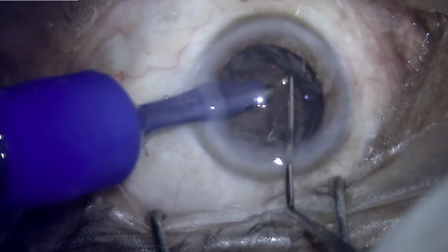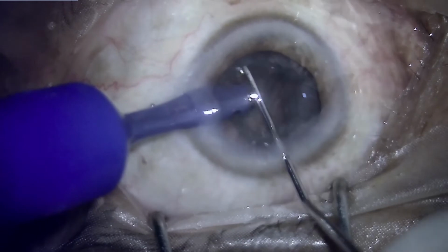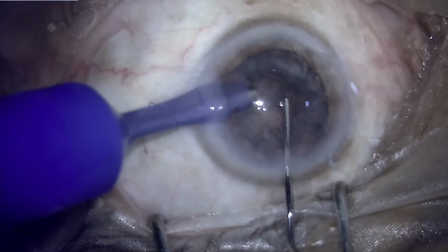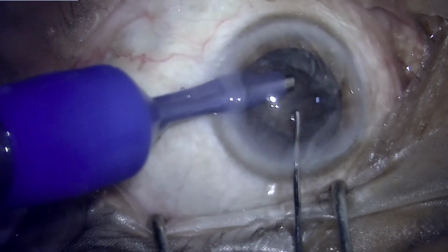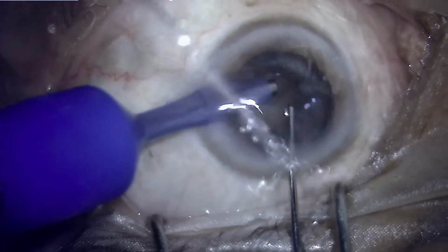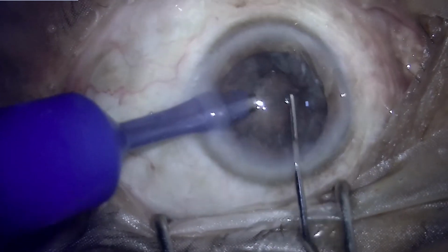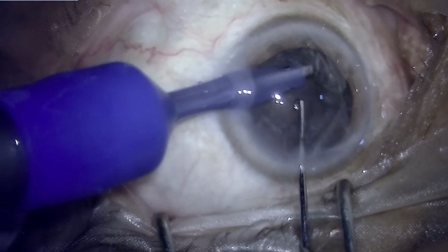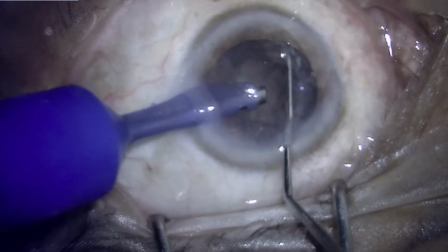So one way of handling these nuclei is to do a chip and flip technique, which works in a way that you create a bowl sort of structure by eating away the central portion, and once this central bulk has been removed, only a central plate and a peripheral rim is left behind, and this can be flipped away from the bag and then can be consumed safely.